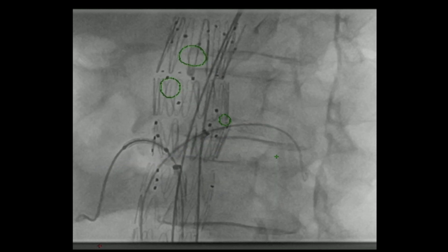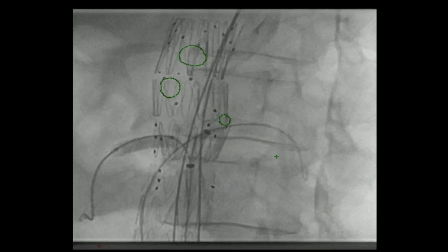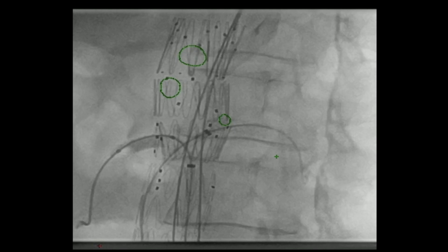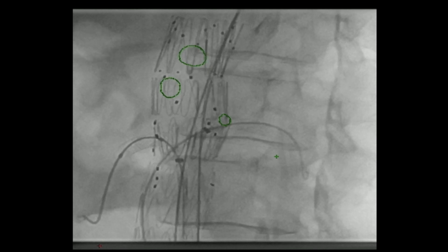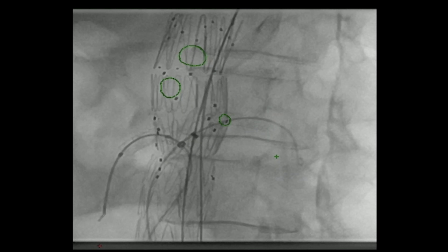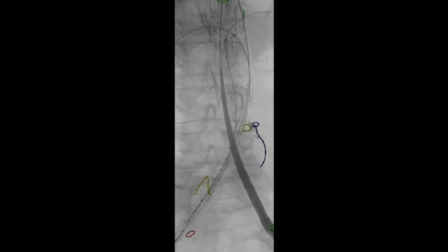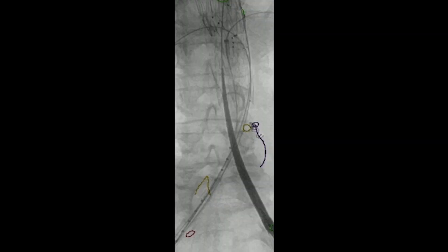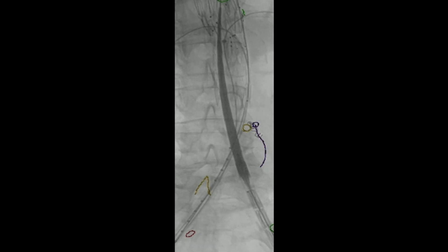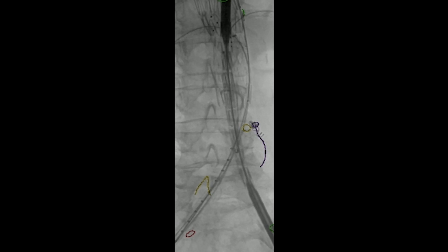We essentially repeat the process on the other side — optimizing the fenestration, deploying the VBX, slowly deflating the VBX while advancing the sheath, then bringing up a 10 by 2 balloon to flare the proximal end. Once that's done, we pull down to complete the distal portion and bring up the bifurcated graft into position. You can see where the IMA has been embolized. We need to know where the bifurcation is — this is more or less like a standard Cook infrarenal graft at this point.